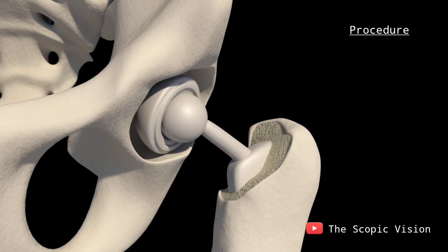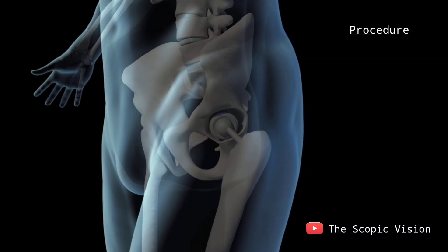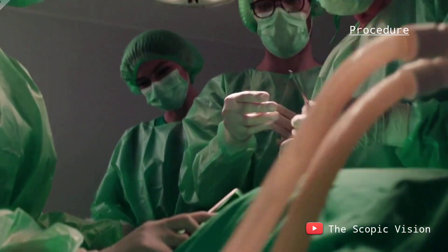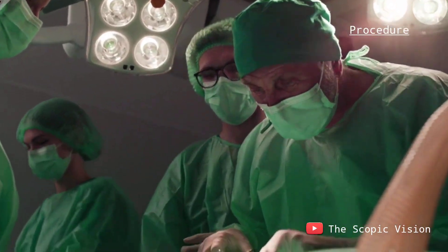Once the components are in place, the surgeon moves the patient's leg to ensure everything is functioning correctly. After confirming proper movement, they close the joint capsule, reposition the muscles, and stitch or staple the incision.